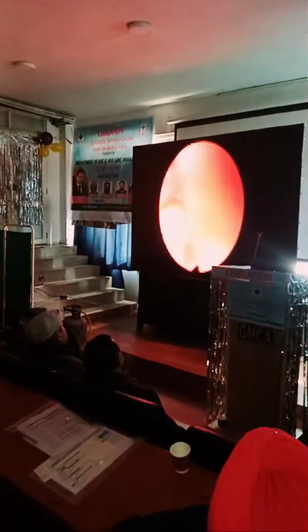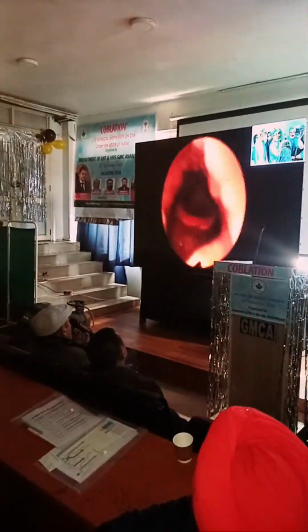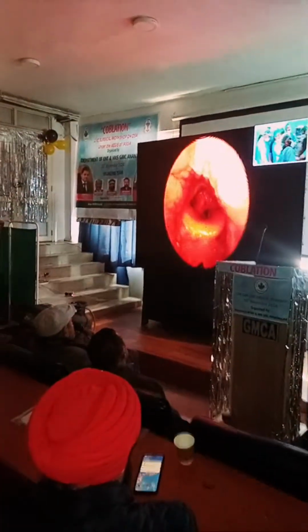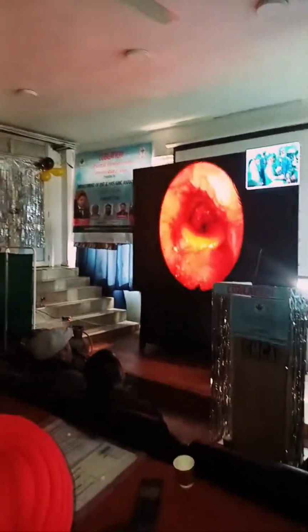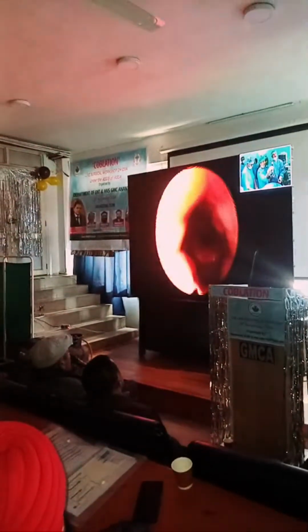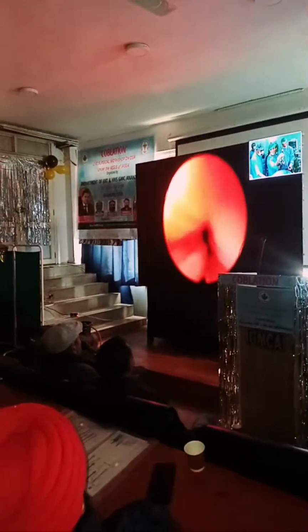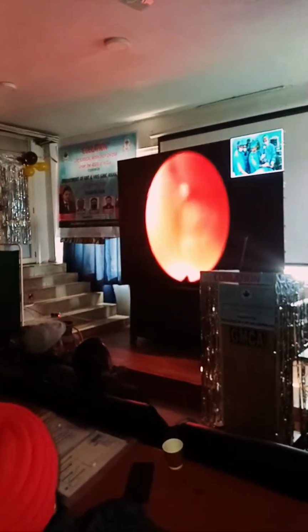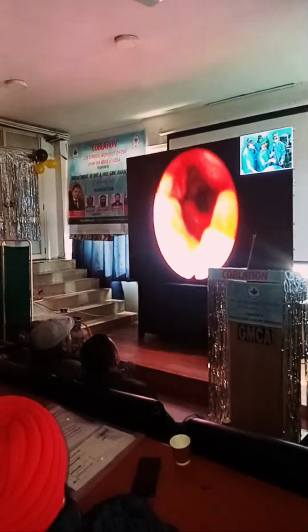Can you increase the light of the scope? Maximum. Put the white balance to maximum. Yes, now it's okay, perfect. We can see well, sir. You can see the laryngeal inlet. There is no secondary collapse. Right now the patient is not completely induced. It will take around 5 minutes. We'll wait for that.